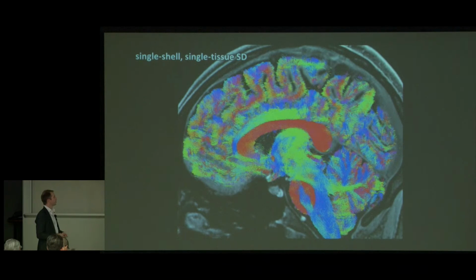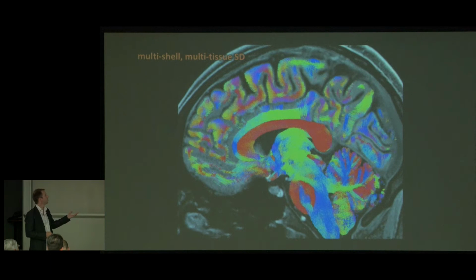And the effect on tractography is also quite impressive. If you look at the whole brain tractography using the current single shell technique, it does a good job, but it's quite messy at the boundaries, and you get streamlines kind of joining between gyri. But if we now track on the white matter FOD from the multi-tissue CSD, you get a much, much cleaner tractography. So it doesn't project through that way.